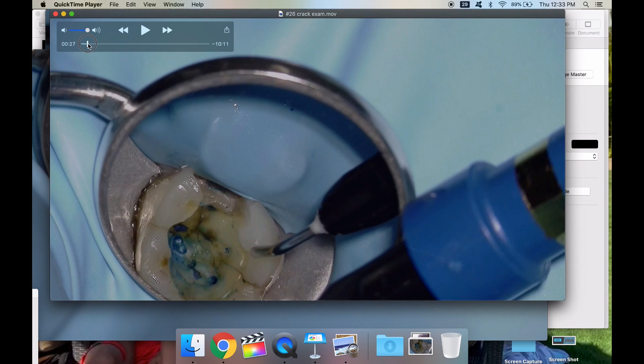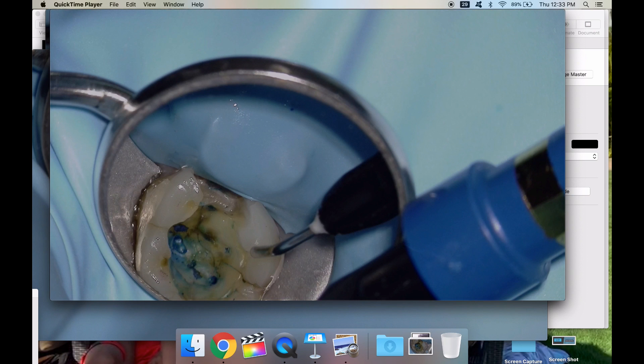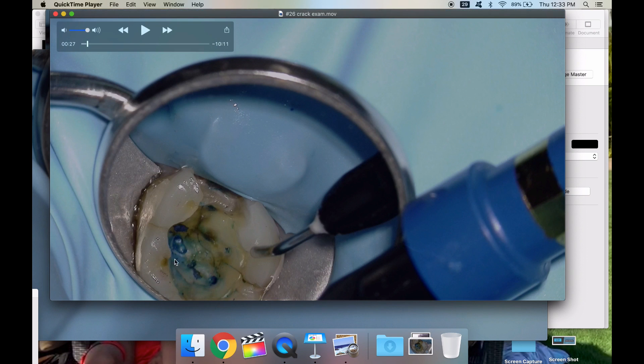This patient was presented while getting a restoration completed with another provider. She's anesthetized and we decided to start the endo at this time. They removed the restoration — this blue is just methylene blue dye — and this is me putting Opal Dam in here. A student was asking me a question so I was pointing out the crack, and the methylene blue dye highlights where the crack is.